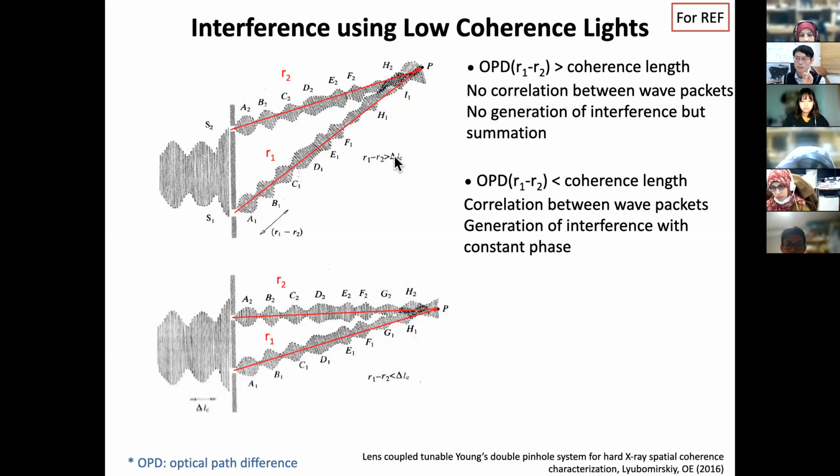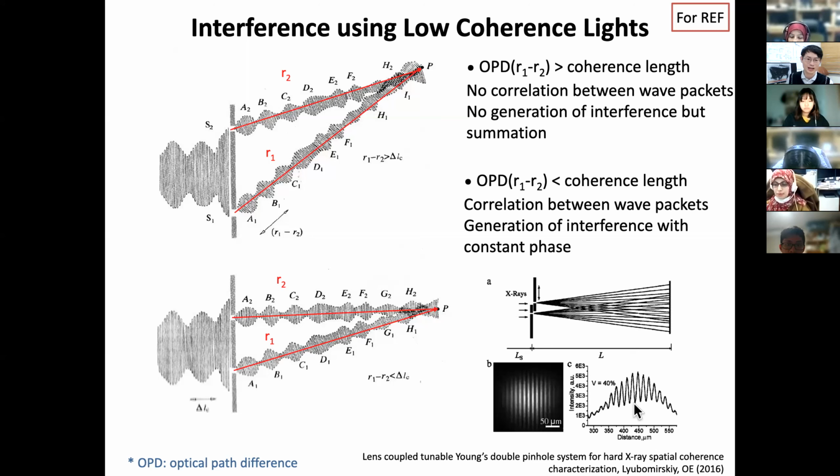Now you start to be, the path difference is beyond the coherence length. What's going to be your output? Now, these two waves do not have a well-defined phase relationship. They will not interfere. You will have, on average, just a DC component. That's the reality.